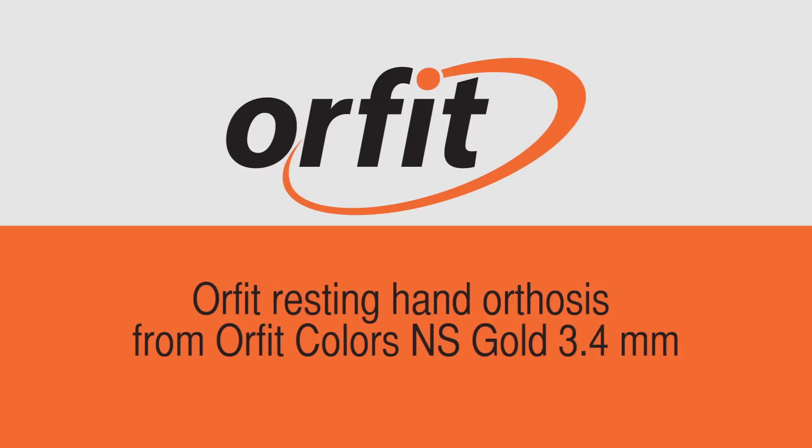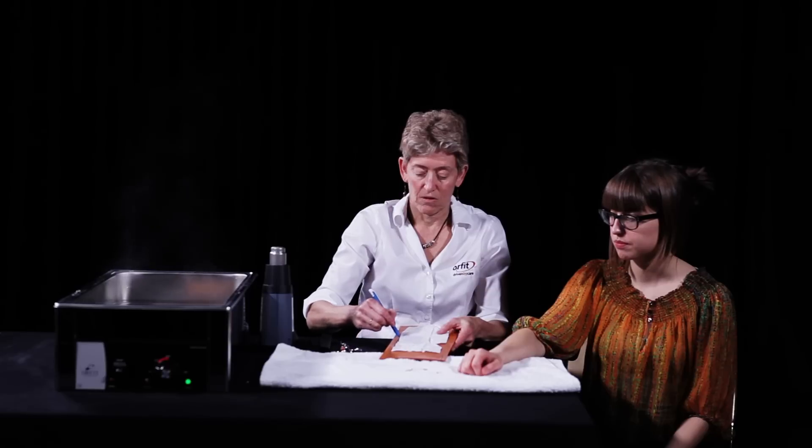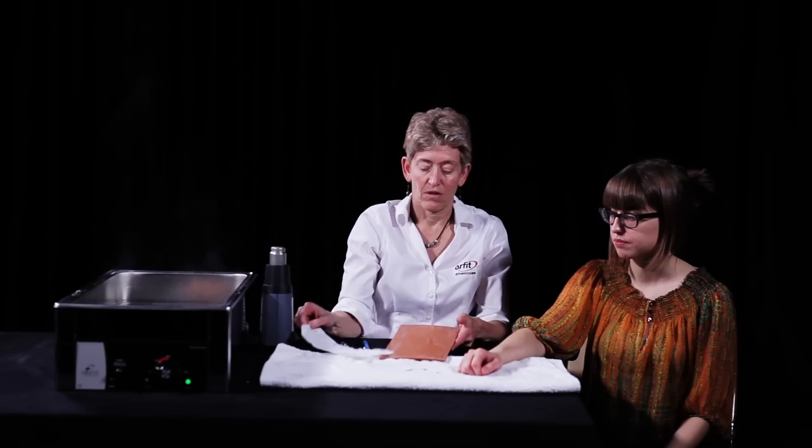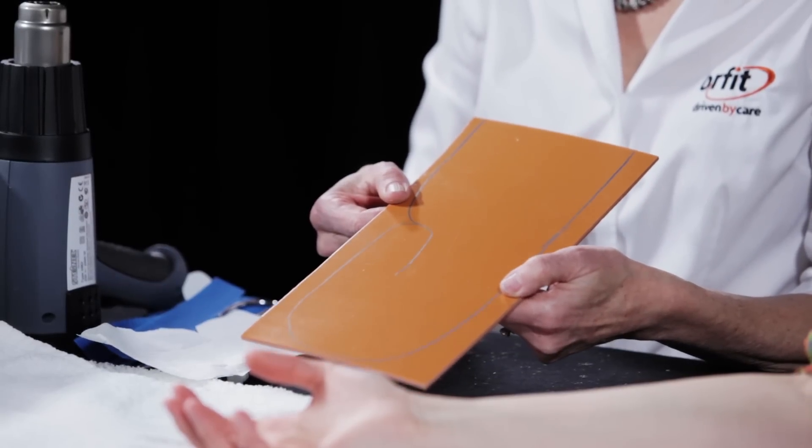Resting hand orthosis from Orfit Colors NS Gold 3.4 mm. This resting hand orthosis is made of Orfit Colors NS Gold in 3.4 mm thickness.